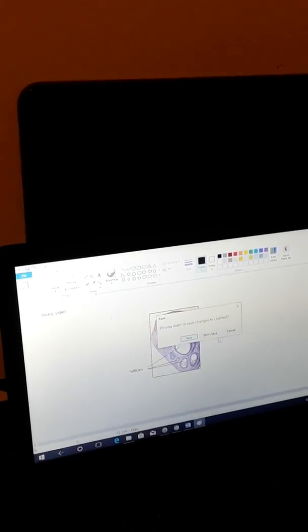The next one that we're going to do, which is the pancreas one, you're going to select it, Control C. You're going to go to Paint, File, open a new one. You're going to not want to save that one. And then you're going to paste. You're going to bring this around. I'm going to go back and just get my, well, I guess I didn't do that. So it'll be the islet and the acinar. So I'm just going to type here, islet and acinar, I believe. Yeah, acinar cells.